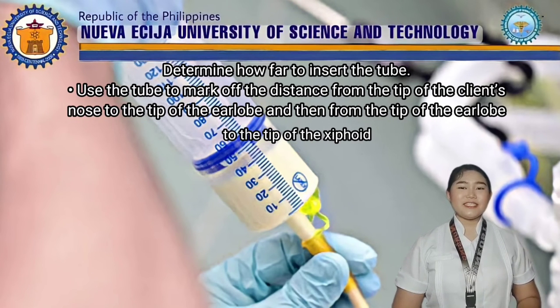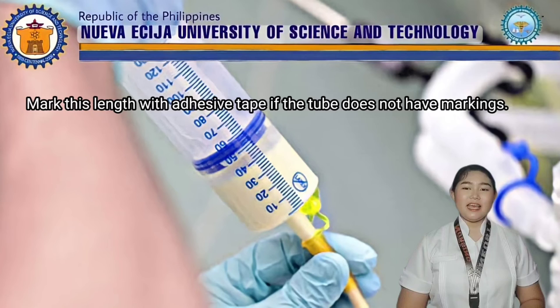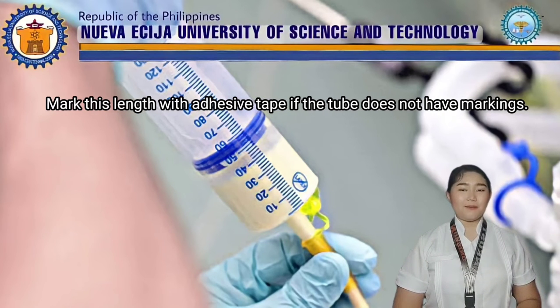Determine how far to insert the tube. Use the tube to mark off the distance from the tip of the client's nose to the tip of the earlobe and then from the tip of the earlobe to the tip of the xiphoid. Mark this length with adhesive tape if the tube does not have markings.